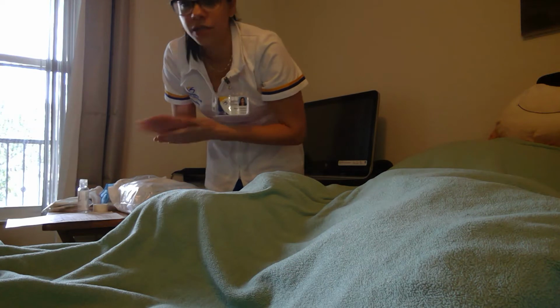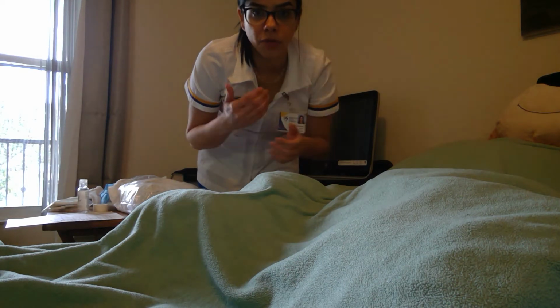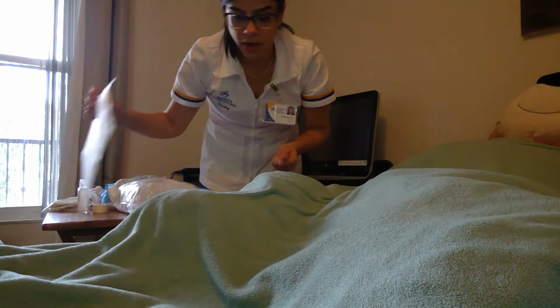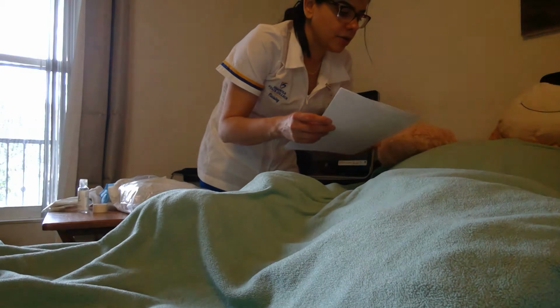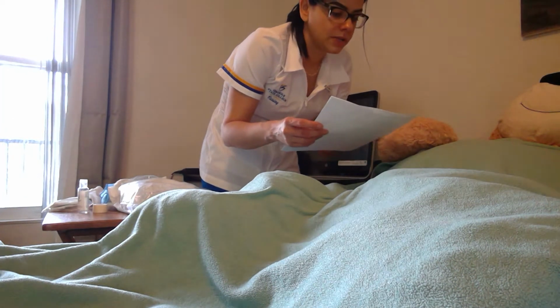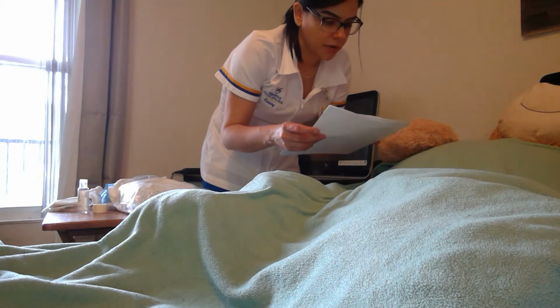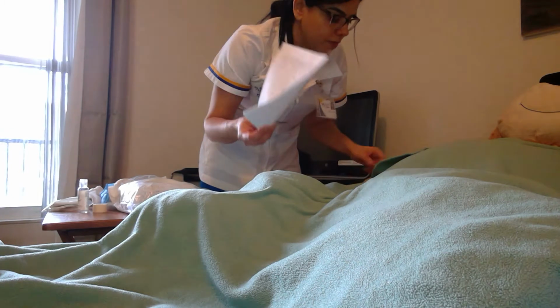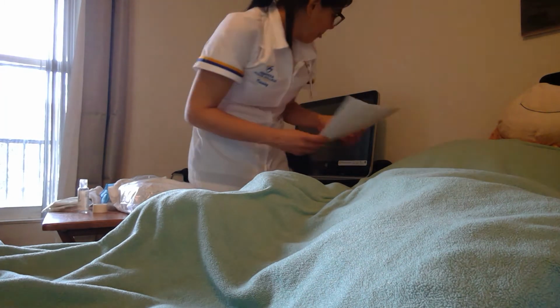I'll do some hand hygiene. And the first thing I'm going to do is make sure that I am with the right patient. So I am going to see her armband, and I'm going to ask her her name and date of birth. Anna Pawlowski, May 5th, 1957. That is correct. Do you have any allergies? Yes, to penicillin, and the reaction on that is hives. Perfect. So this is her. She has stated her allergies. Okay.